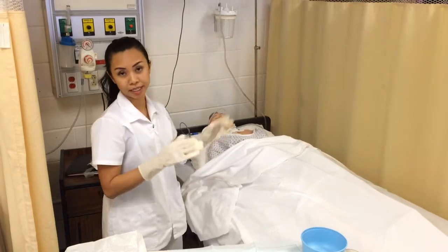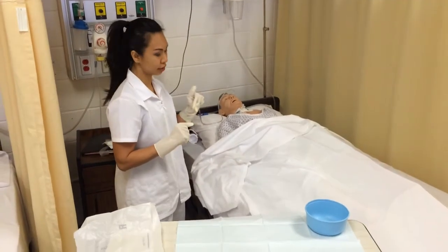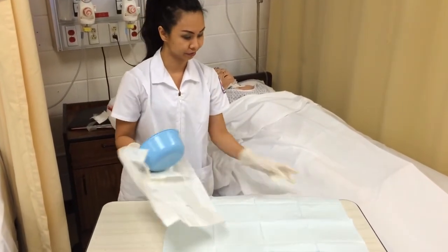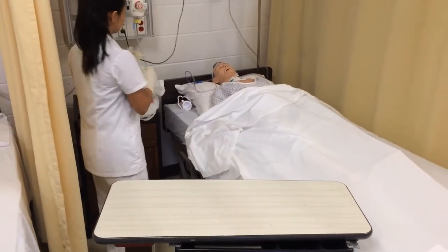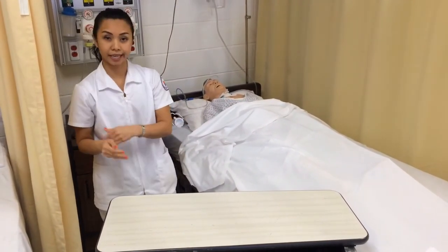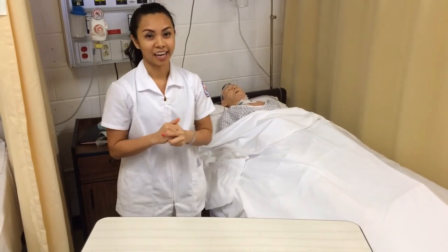I make sure the patient is comfortable, lower the bed down, and put the call light within reach. Then I clean off my working area, take my gloves off, and wash my hands. Finally, I document the intake, output, and condition of the wound.